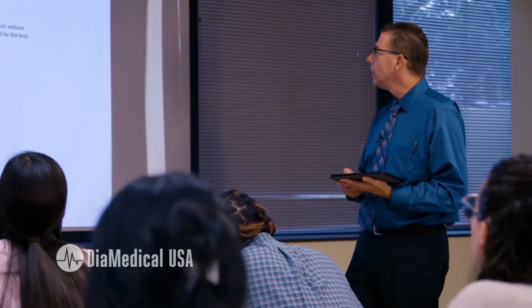Which of the following would be the best recommendation for this patient? Would you put them on A, CPAP mask of 10, an FiO2 of 40, B, BiPAP with 12/6, 50%, C, change to high flow nasal cannula. What I really liked about the questions were that they challenged me and they really helped enforce clinical application of managing a patient on a ventilator.